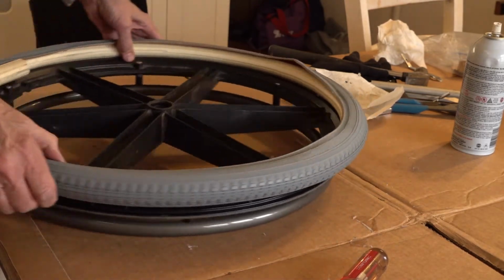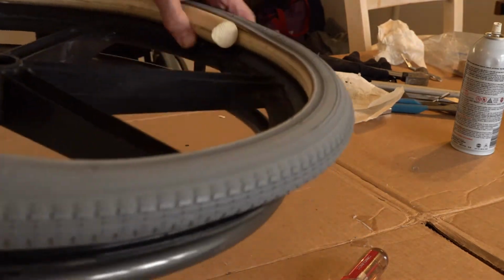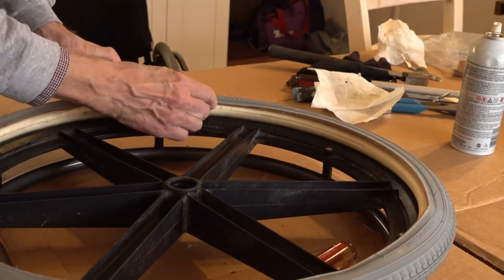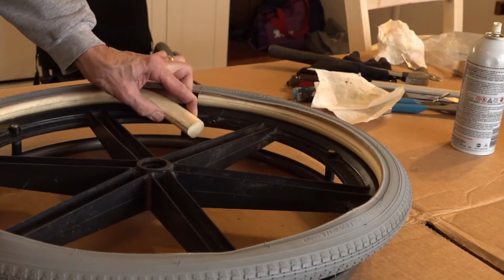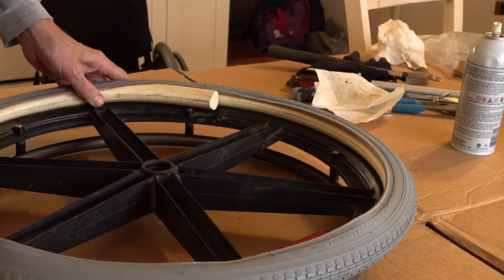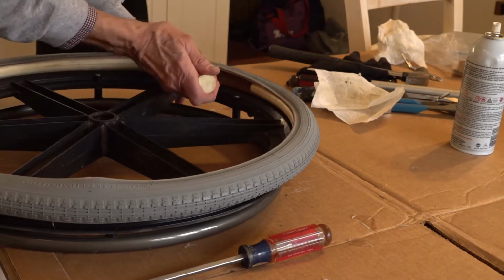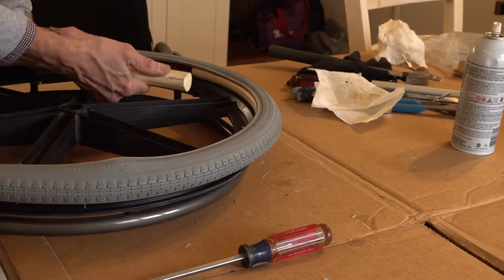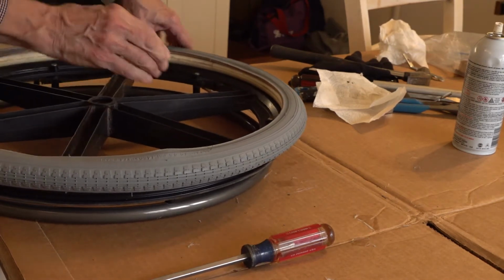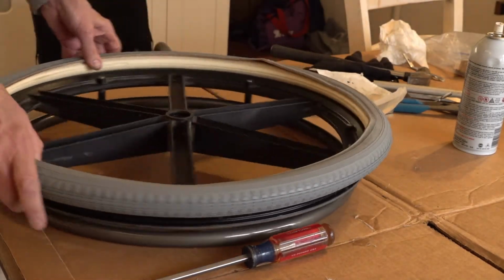You have a little discovery. It appears that the piece has grown a little bit. There's a bit of an overlap. It's not going to go in because we've got about an inch or so overlapping the edge. Trick to that is to pull it out, put the ends in together so they're pushing against each other. Now snap it in, and voila, that's all the way in.